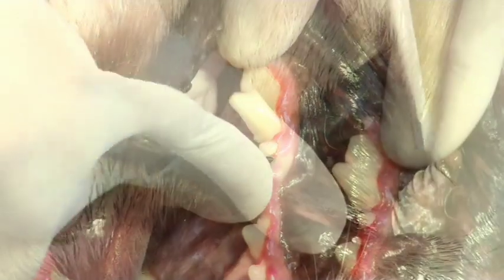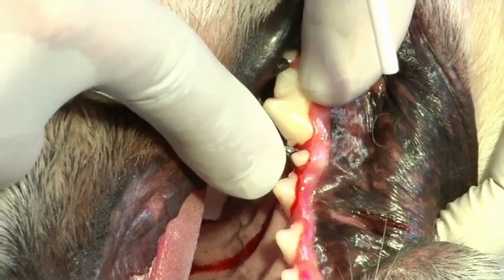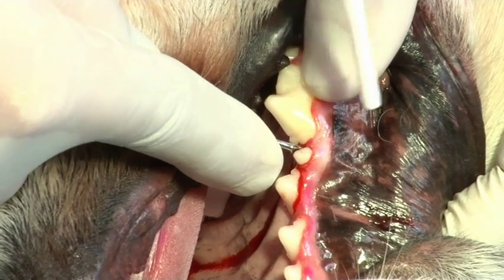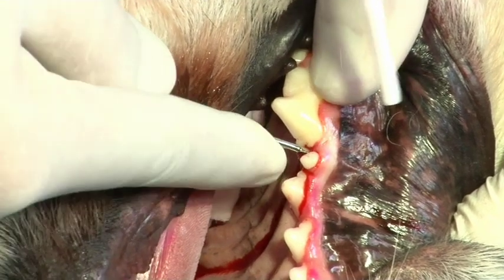The elevator is then applied to the distal side and again, with a rocking action, worked along the root. We can then rotate and hold with the elevator for 10 to 15 seconds. This will tear periodontal ligament fibers and cause bleeding within the alveolus.